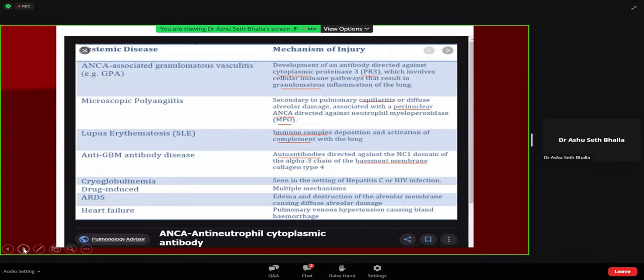And that is how, whenever on imaging, plus you are aware of the characteristic clinical manifestations of hemoptysis in up to 60% of the patients, drop in hemoglobin, rapid clearance, all that is supportive, you set out to look for a cause. In the cause, the first thing we ask is what is the status of the skin and what is the status of the kidney.